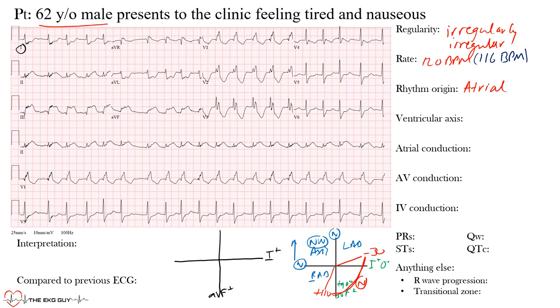Looking at lead aVF, we can clearly see the complexes are above baseline — mainly the initial portion — so positive complexes going toward the positive end of lead aVF places us in the right-inferior quadrant. Because lead I is roughly isoelectric and aVF is positive, the axis lies somewhere in the right-normal range.